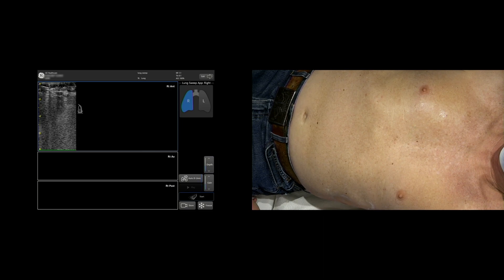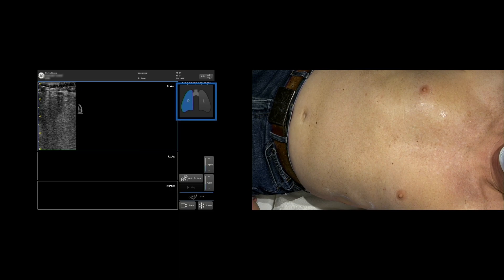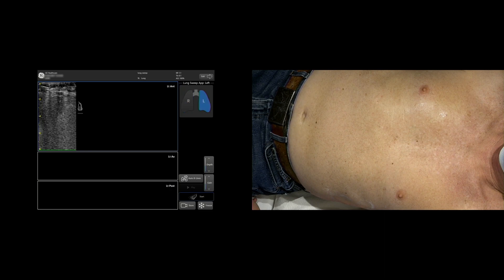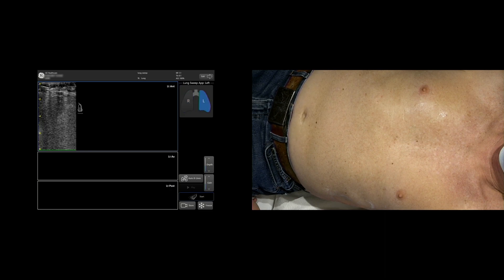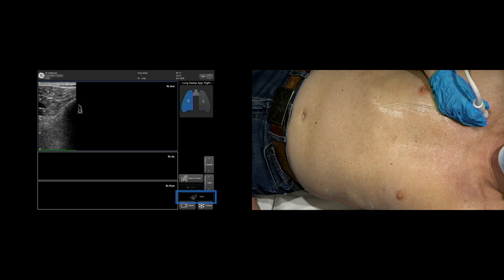Select the side that will be scanned by tapping right or left on the lung icon. The selected side will be blue. In this case, I will scan the right side. To start the sweep, tap Start.